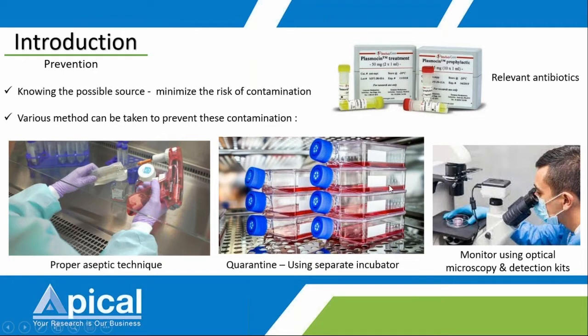And finally, always observe and monitor your cell culture on a regular basis. How are you going to monitor? You can use optical microscopy or a detection kit. If your lab is prone to contamination, detection kits are a must.